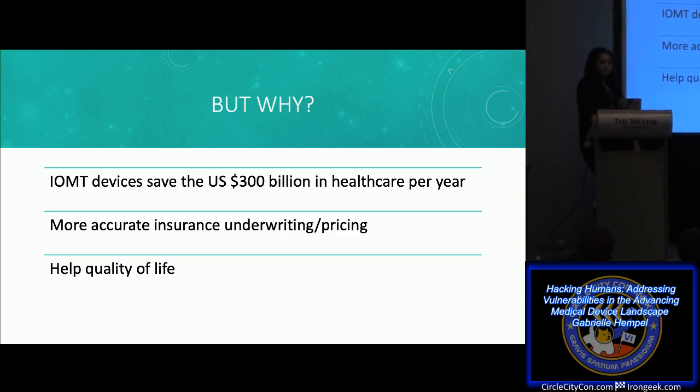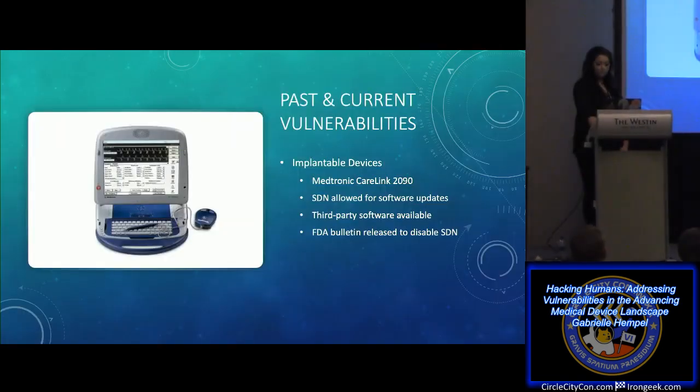These devices will also help improve the quality of life for many of the patients that use them. Remote monitoring is made possible by connected medical devices and allows healthcare providers to capture patient data instantaneously, as well as allow the patient to live their life more normally than they previously may have been able to.